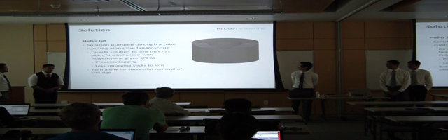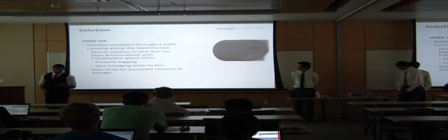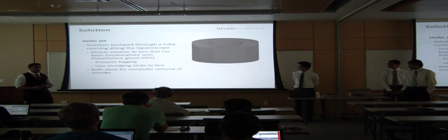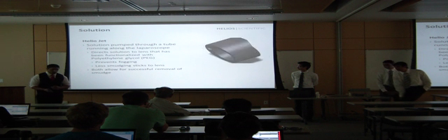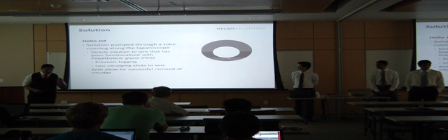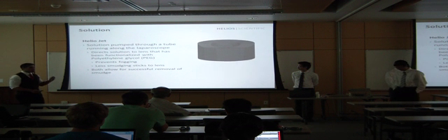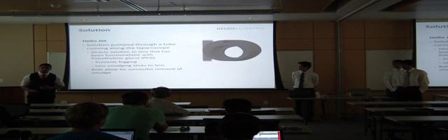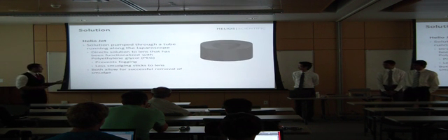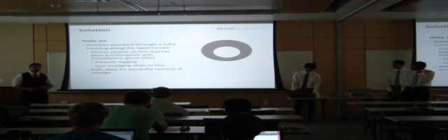As was said before, there are two major problems with laparoscopic surgery: fogging and smudging. There are two ways to approach this, mechanically or chemically. The mechanical solution applies some sort of wiping or spraying motion to remove the fog or smudging. A chemical solution coats the glass shield with a chemical that will prevent fogging or smudging, letting water slide down the shield. We found out that the best way to solve the problem is a combination of both.